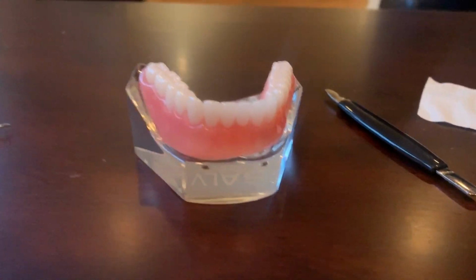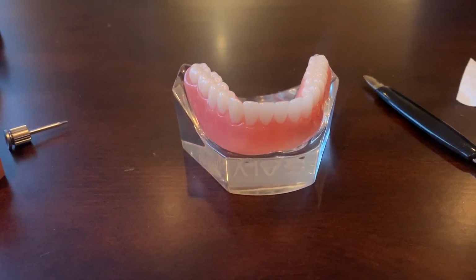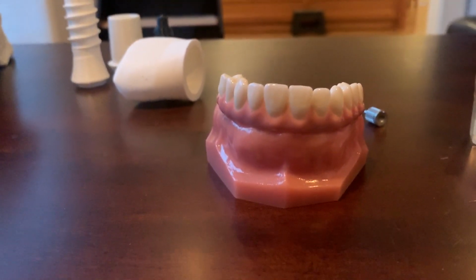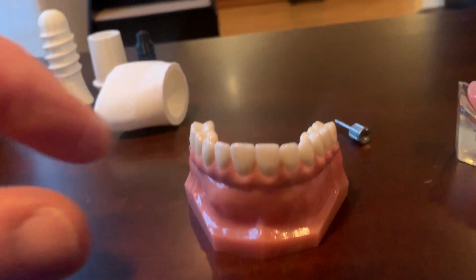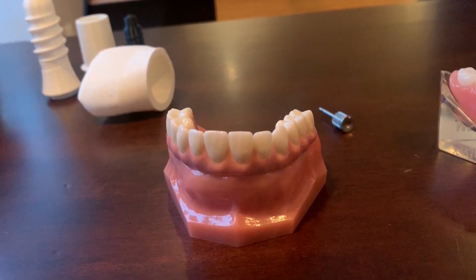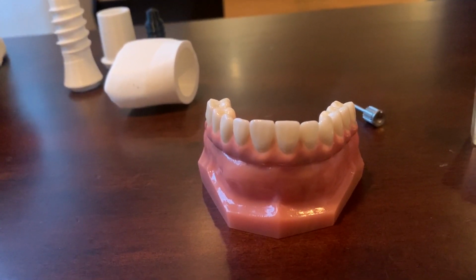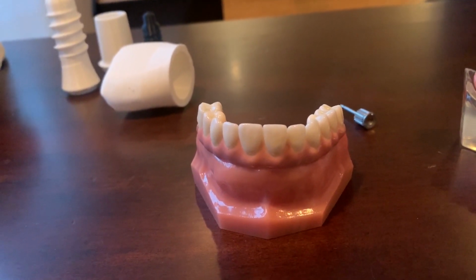Most people that are missing teeth have been missing teeth for different amounts of time. So when we make these full mouth prosthetics, this pink tissue here essentially replaces the amount of bone that they're missing. If somebody comes in and they haven't had teeth for years and years and years, and they're missing like this much bone, we can't just put teeth in there that are floating in thin air. We have to put a prosthetic in there that replaces what they're missing. Otherwise, the teeth will be really short and in the wrong place.